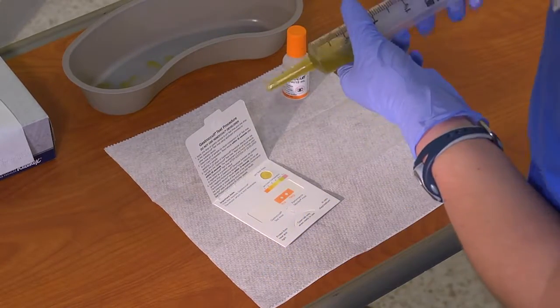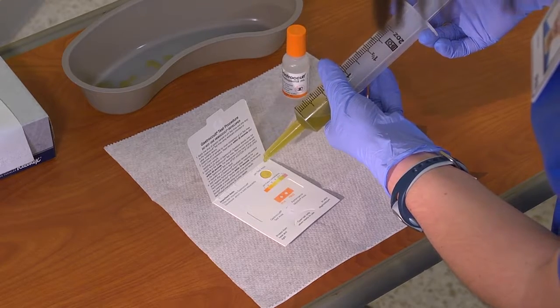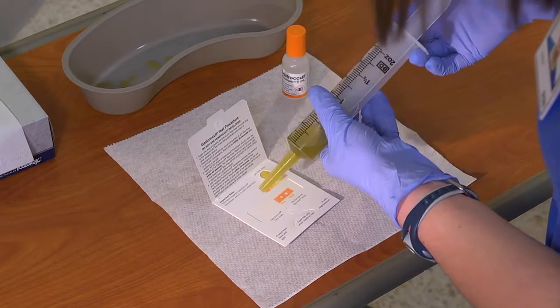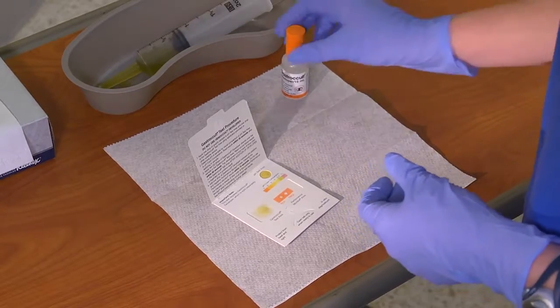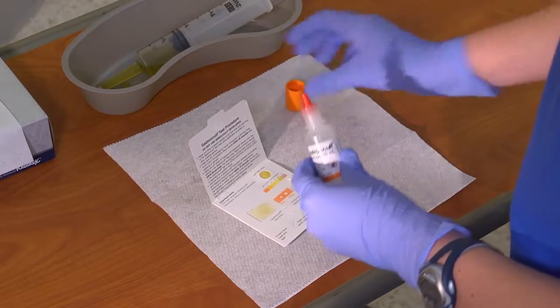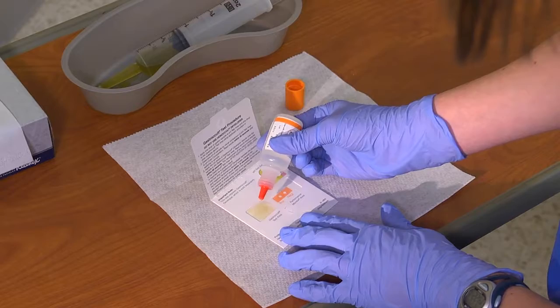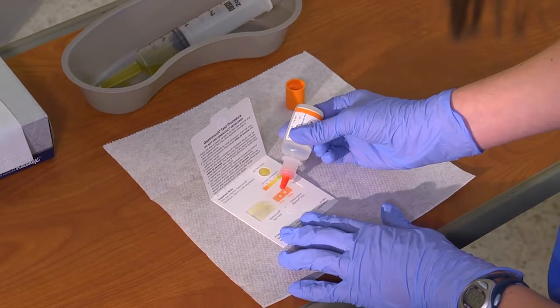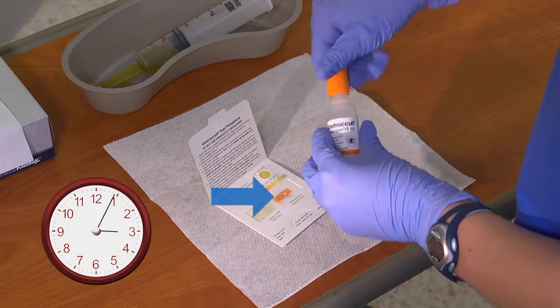To perform the gastro-occult test, use the bulb or catheter-tip syringe to apply 1 drop of the gastric sample to the test slide and pH test area. Then, apply 2 drops of the developing solution over the sample and 1 drop between the positive and negative performance monitors on the slide. Within 30 seconds of applying the solution, verify that the performance monitor has turned blue.